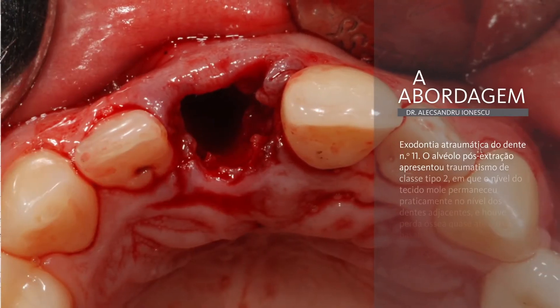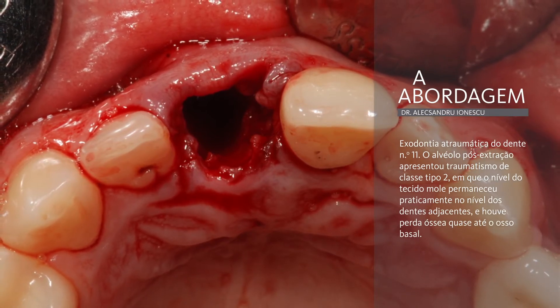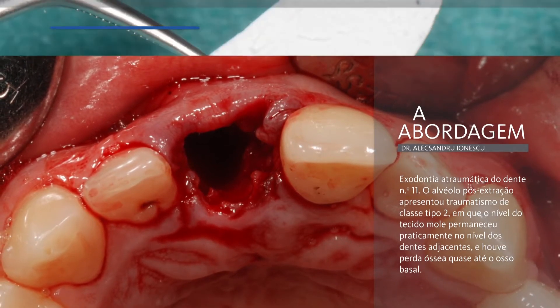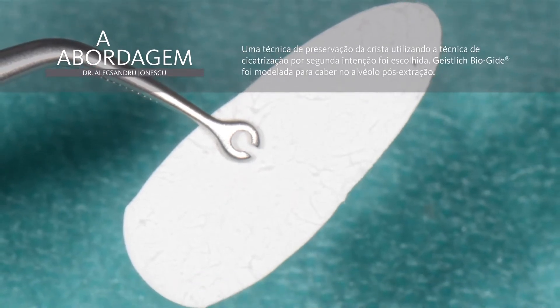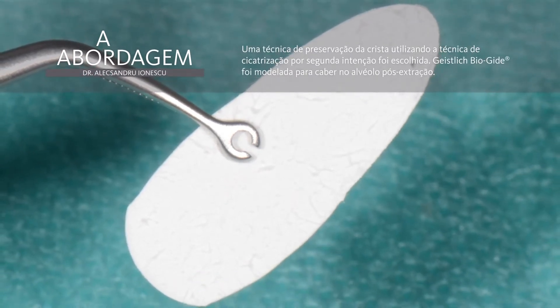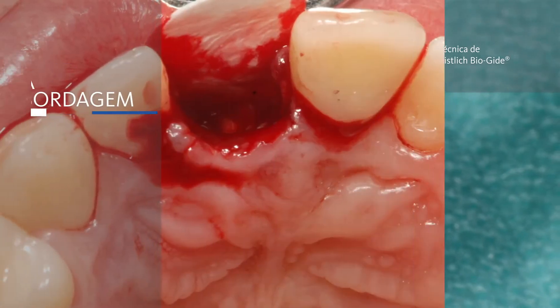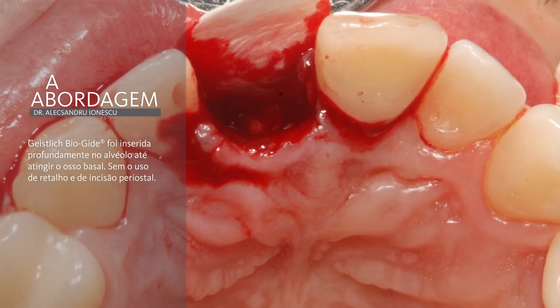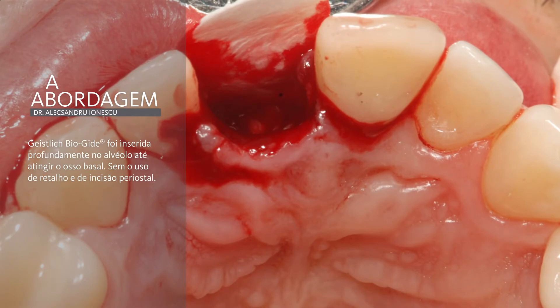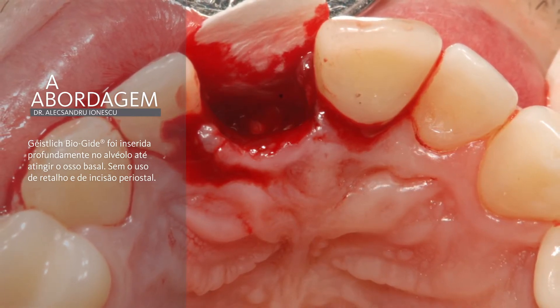Tooth 11 was extracted atraumatically, and a socket preservation procedure was performed respecting the open healing protocol. The Geistlich Bioguide membrane was shaped to fit the post-extraction socket and inserted deeply into the alveola down to the basal bone. There was no flap raised and no periosteal incision. The alveola was grafted with Geistlich Bio-Oss small granules, highly condensed to fix the membrane in the apical region.